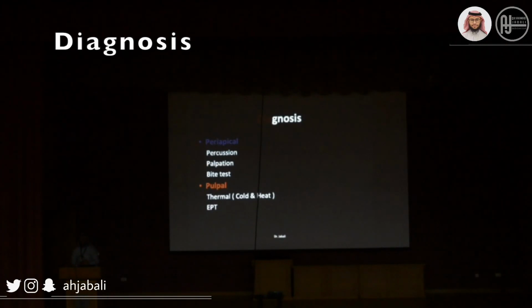For pulpal examination, we have either a thermal test, which is cold, or a heat test, and the cold is more accurate than either the heat test or EPT. Also, you need to tell your patient before you apply the cold test that I'm going to use cold. If you feel pain, raise your hand until the pain goes away.